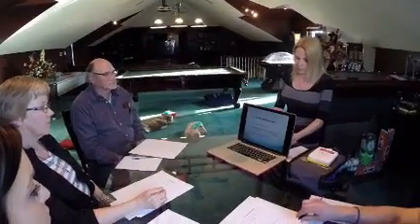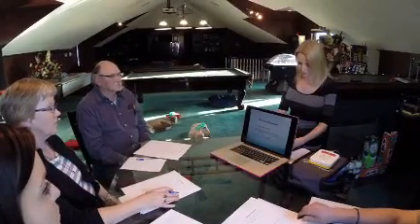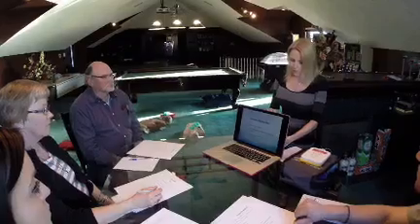And it will analyze the heart's rhythm, decide if it's shockable or non-shockable, then it will tell you to start performing CPR. The nice thing about the AED is it's always talking to you and telling you what to do. So all you have to do is listen and follow the instructions. Most AEDs will have a ticking sound for you to keep time to when you're performing the CPR. 2 minutes of CPR is doing your 30 compressions and 2 ventilations 5 times. But don't worry too much about that because the AED machine will actually take all that into consideration for you.